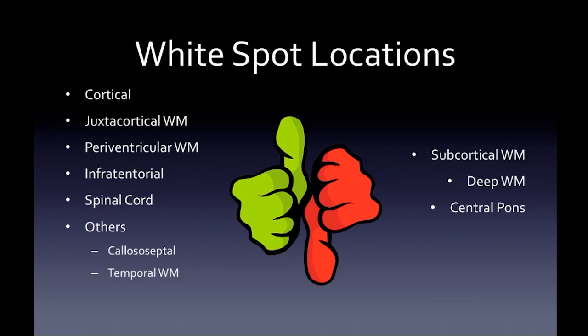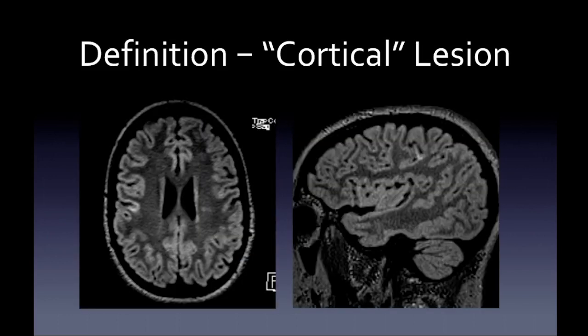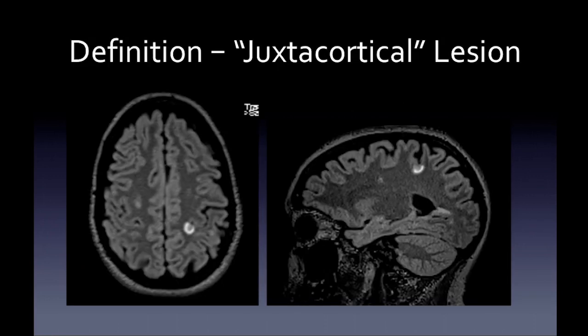For cortical lesions, you can see a lesion in the cortex here with the yellow arrow. These are best appreciated on double inversion recovery images, though you can window a 3D FLAIR similarly. The cortical lesion location is new for the 2017 criteria. For juxtacortical lesions, the lesion must touch the cortex — there cannot be any normal-appearing subcortical white matter between the lesion and the cortex.